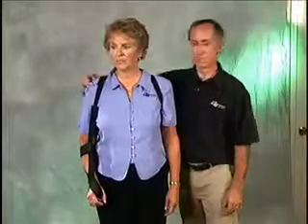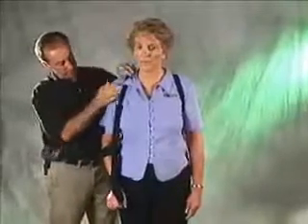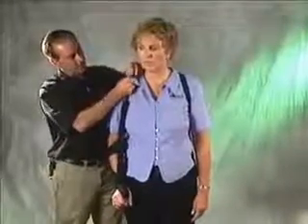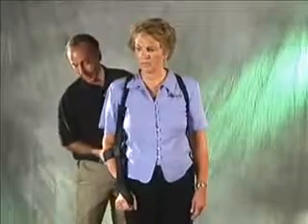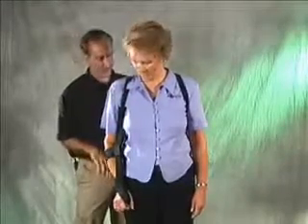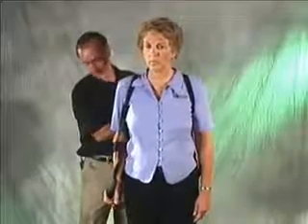Once you have the sling on, you can adjust the sling to reduce the subluxation. We can then adjust the tension — we want to reduce the subluxation by tightening the anterior and posterior straps. Notice the client is in a little bit of internal rotation; you can reduce that by tightening the posterior strap relative to the anterior strap.